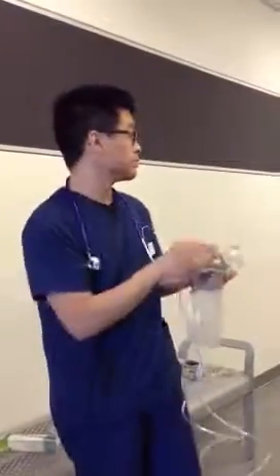When the patient exhales in a partial rebreather, not a non-rebreather, partial rebreather, since there is no bag flap, a third of the bag will fill up.